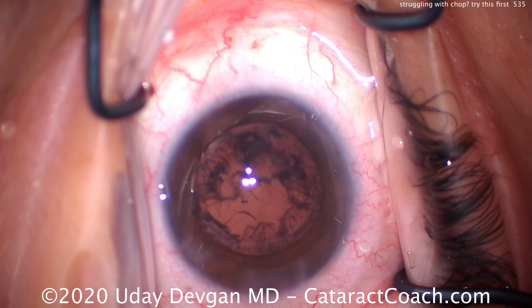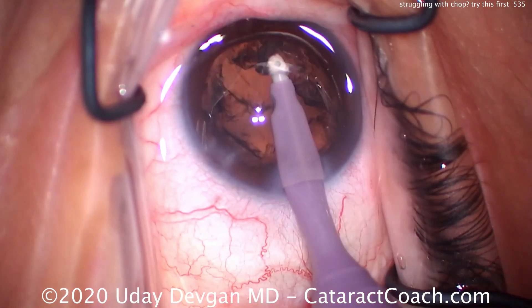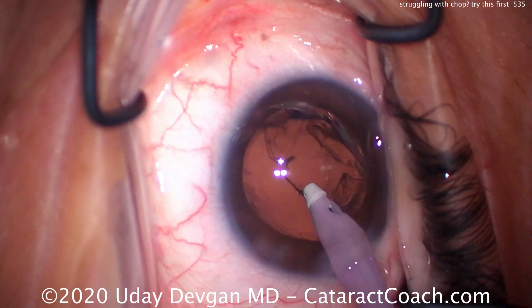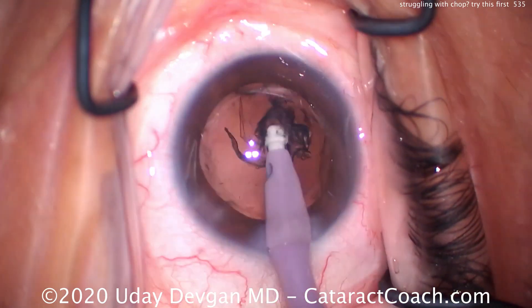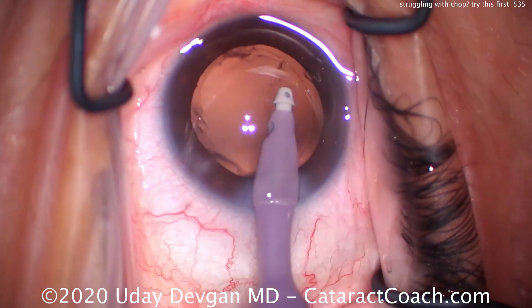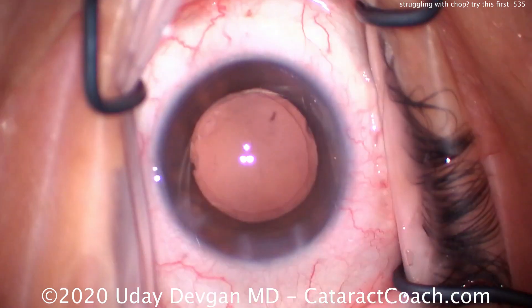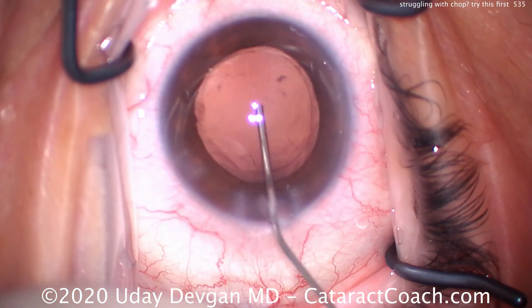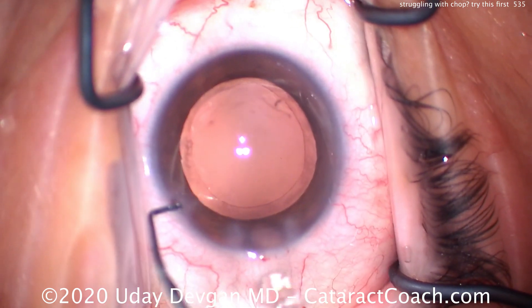So if you're trying to do FACOCHOP in the capsular bag and you're having a tougher time with it, try doing this technique — flip and chop. Getting the nucleus out of the capsular bag buys you freedom of time. Then you just put the FACO probe in front of the nucleus, the chopper goes around the part that's flipped out of the capsular bag, the two instruments are brought together and apart, and you have a complete separation into two halves. It works well on cataracts with a nuclear density of about two to three-plus nuclear sclerosis. If it's very dense it may not be as good, and if the lens is very soft this may not be ideal — it's hard to sometimes get a chop in any lens that's very soft.